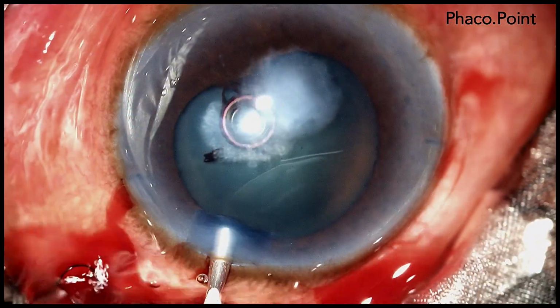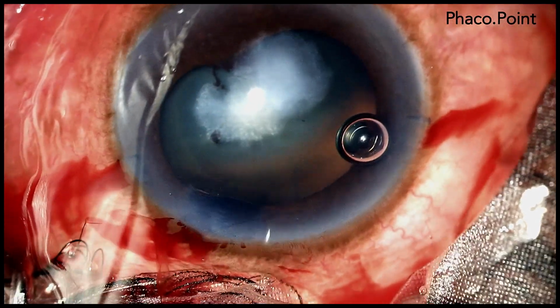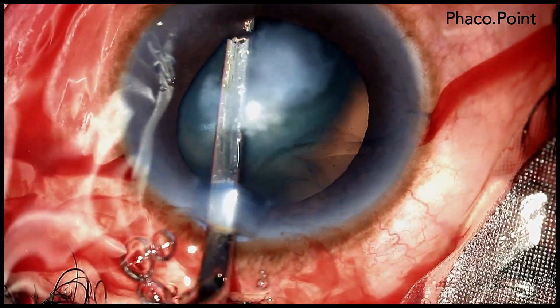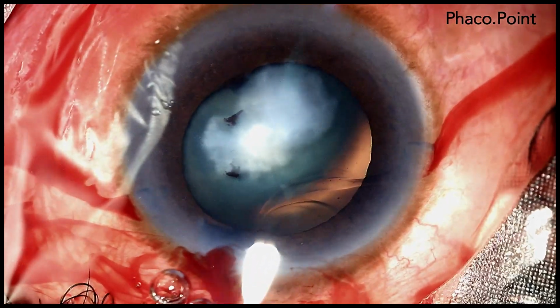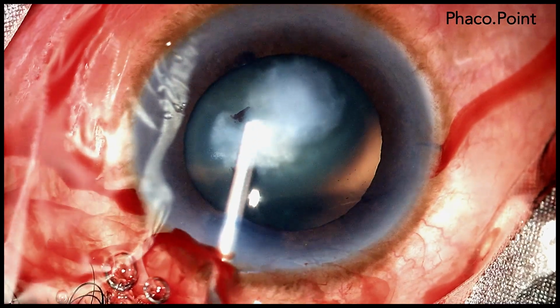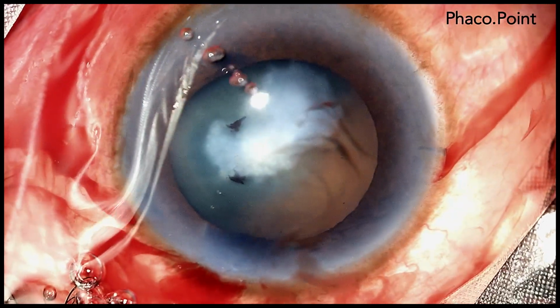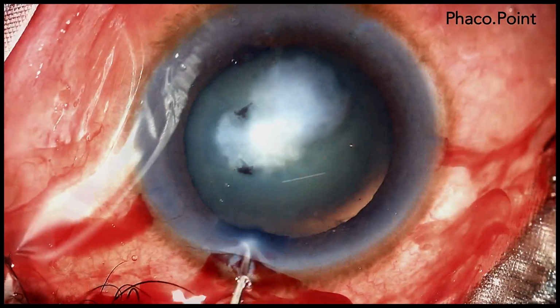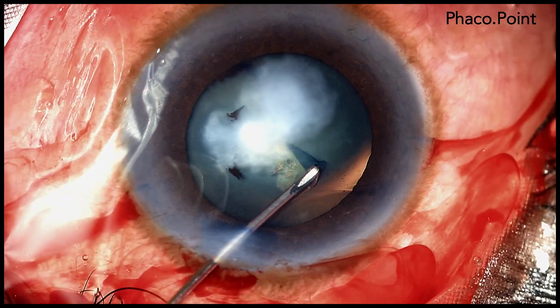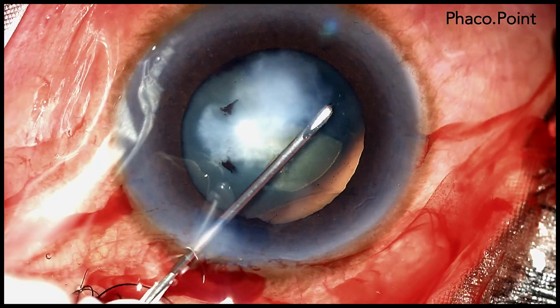In order to attempt an inferior synecholysis, some viscoelastic is introduced into the anterior chamber. After which, as you can see, an iris spatula sweeps under the iris, resulting in the successful breakdown of the posterior synechiae. Some more viscoelastic is then introduced into the eye, after which we are now ready to proceed with the capsulorhexis. With a well-fashioned cystotome, I start my capsulorhexis superiorly in the area of the clear cornea.